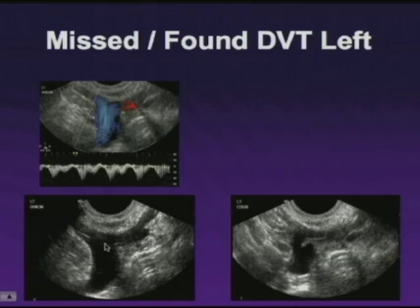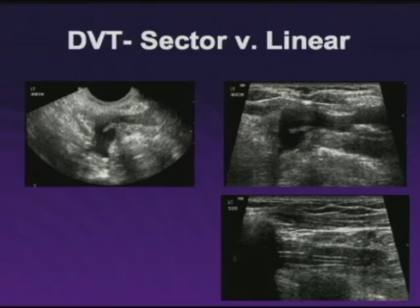And as we change our orientation and scan back and forth across that vein, now we can see from a different plane the thrombus, which is now projecting in a different plane, again front to back, and we can now diagnose acute deep venous thrombosis. The same thrombus which we did find could be seen with a linear array probe, and so we can appreciate the fact that we can use a variety of probes that are helpful to us.